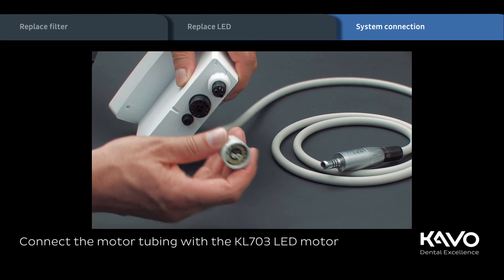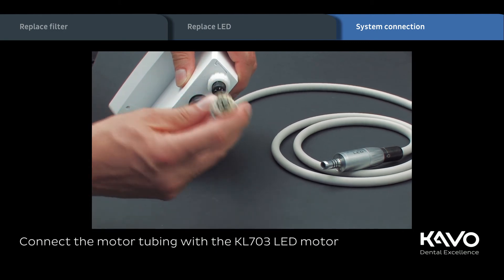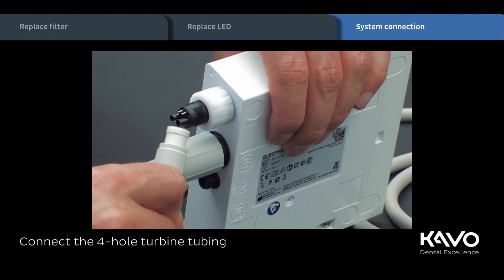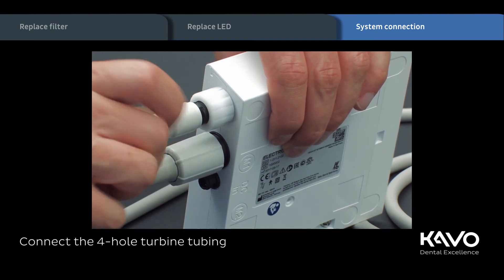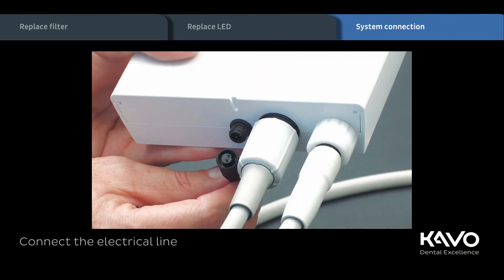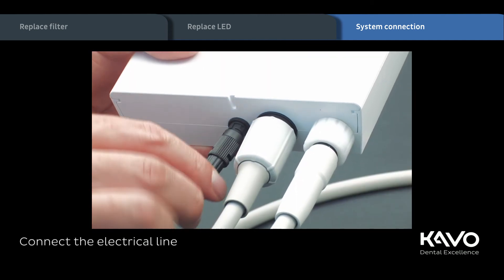Connect the motor tubing with KL703 LED motor. After that, connect the 4-hole turbine tubing from your treatment unit. Connect the electrical line and the system is ready to use.